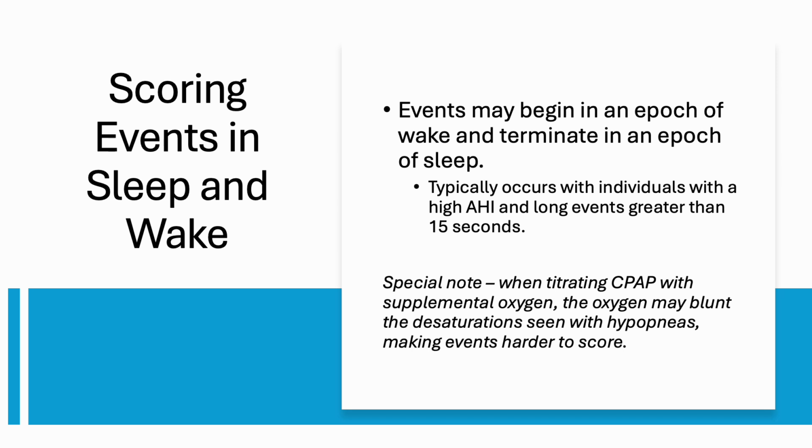Also, whenever we have a patient on supplemental oxygen, that may give imprecise desaturation values. So we should always document when we think we see a hypopnea but there are no desaturations, because the oxygen may be to blame.